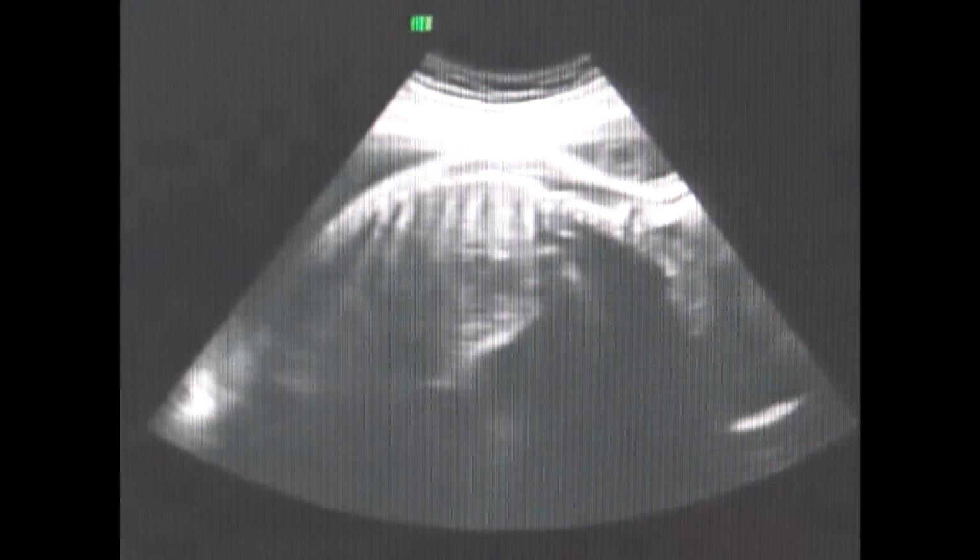It's enough to float. So all this little area right in here, you can almost see where it doesn't separate, but it comes away from the head a little bit. That's why that little black line is right there. So that's her hair. It's not a lot, but not bald. She's moving. It shifts into a little heart. See it being right there. Oh yeah.